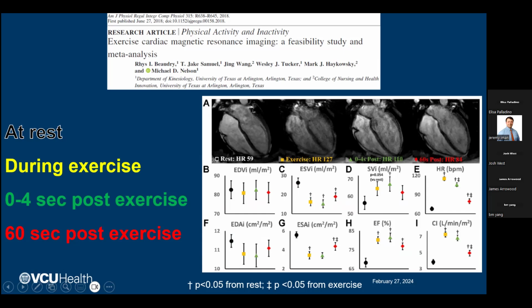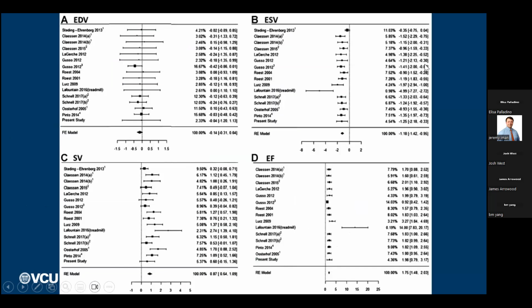These are the red dots compared to the black dots at rest. There's a difference compared to rest, but there is a decay that you're experiencing already in healthy subjects. So they have a pretty good recovery compared to some patient populations. But nonetheless, it gives you a little bit of a profile of the differences in sensitivity, looking at different time points following exercise.